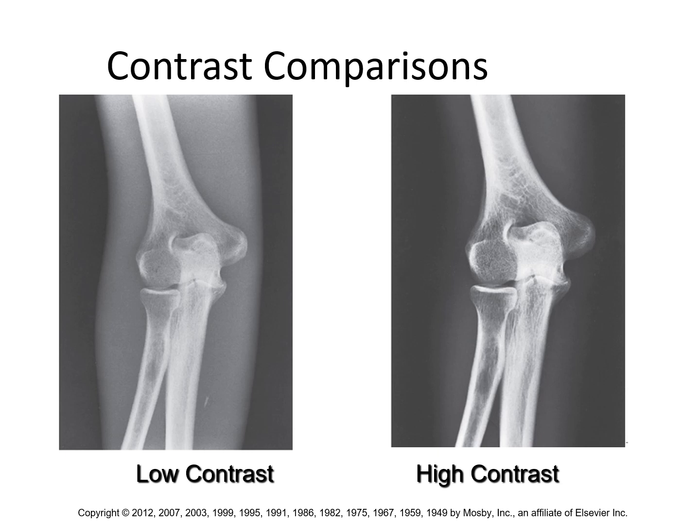We have a low contrast, that is, a longer grayscale with lots more shades of gray, but the differences between shades of gray are very, very subtle on the left. On the right, there are fewer available shades of gray in our grayscale. Things are either more black or white. Okay, you can do a quick experiment. Just try to count the individual colors in the left-hand image.